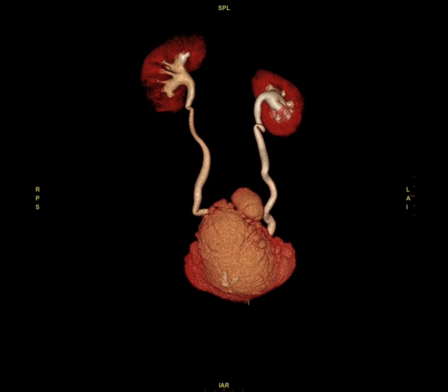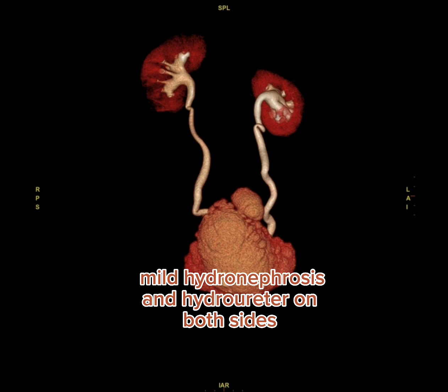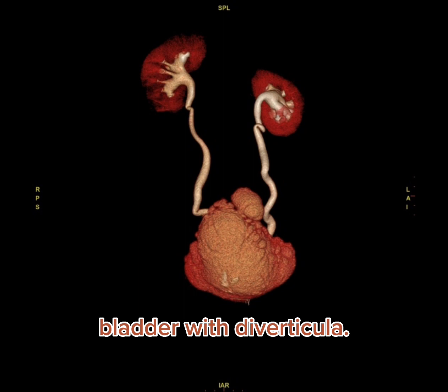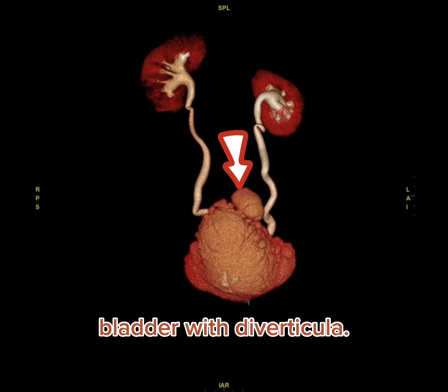Same patient with 3D volumetric reconstruction showing mild degree of dilatation of the pelvic collecting system and both ureters, while we can see multiple variable sized small diverticula especially along the dome of the urinary bladder, where a relatively prominent sized diverticula is also identified.